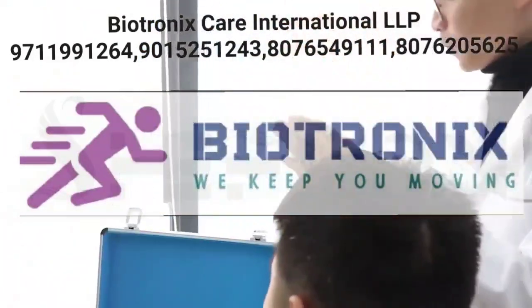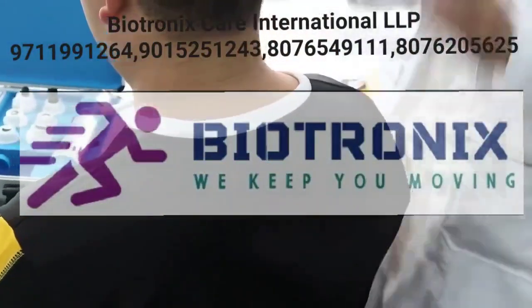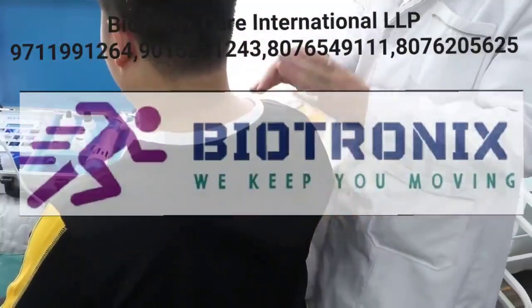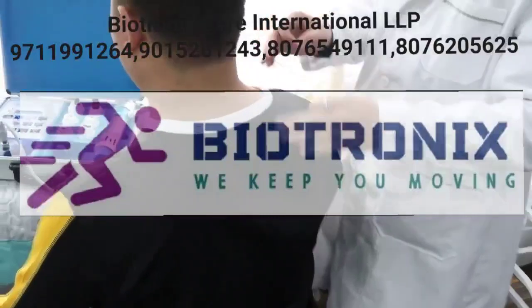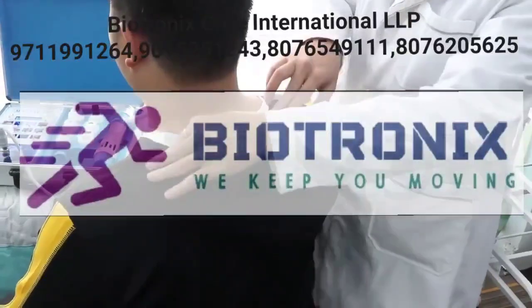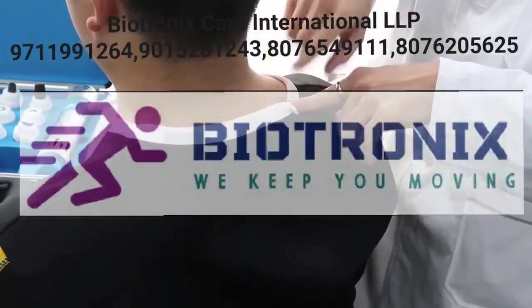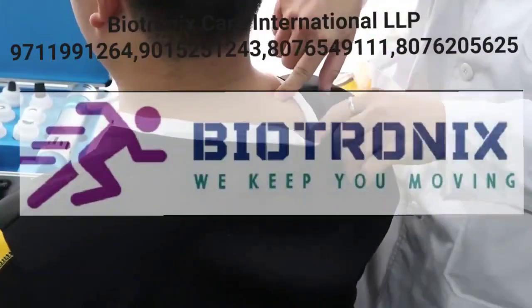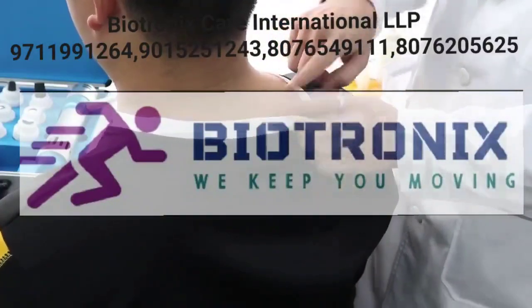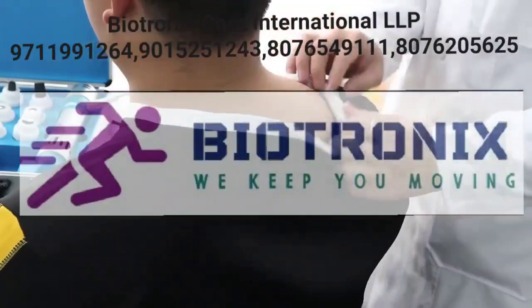We cover the tips. And before you do the treatment, firstly on the patient, on the clients, how to do the treatment. For your body, every area of the body, different clients, maybe their pain is different. You just ask the client to press it to find which area they feel pain, they feel uncomfortable. Just find the pain points. For example, this area, the client said this area they feel pain, so now we find out the treatment area over here.